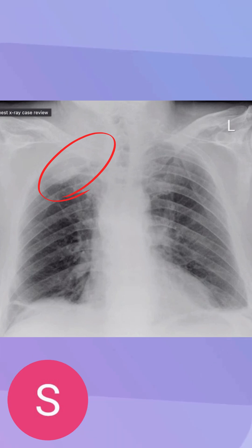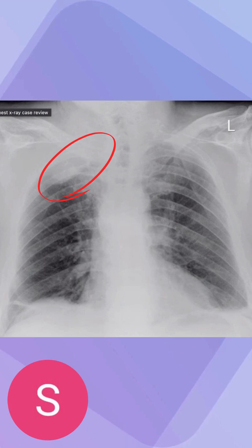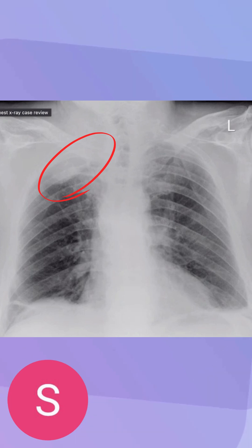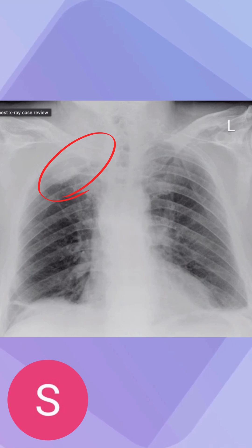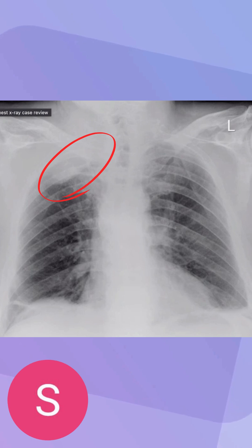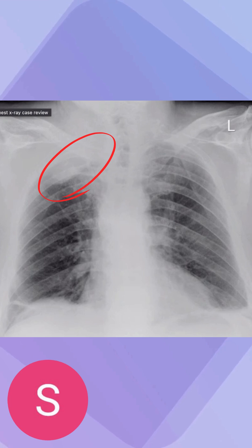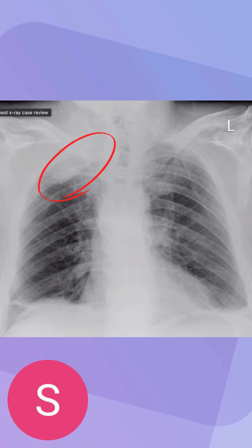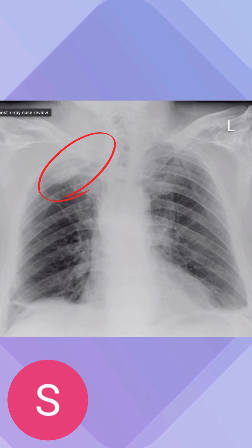However, another issue we can pretty clearly see is in the right lung. Both lungs are pretty symmetrical — we can clearly see the boundaries of each lung. But in the right lung, we can see a large white area in what should be lung tissue, compared to the symmetrical left lung. That's a sign where there could be a tumor or a large mass growing there, and that would need to be addressed.